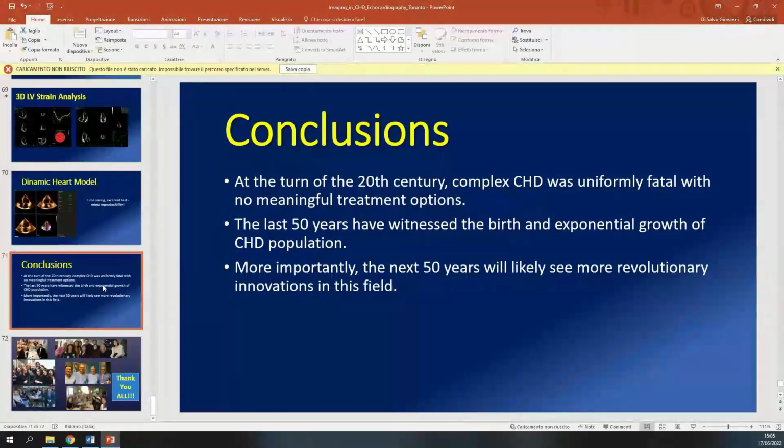In clinical practice, with the current software, it is not time consuming. As I showed you in the previous slides, nowadays we just need to acquire the 4-chamber view, 2-chamber view, and 3-chamber view, and the software will get ejection fraction, volumes, and GLS. So, in my opinion, with the top-of-the-range machines available nowadays, it just takes a few seconds. So it's completely integrated in clinical practice.